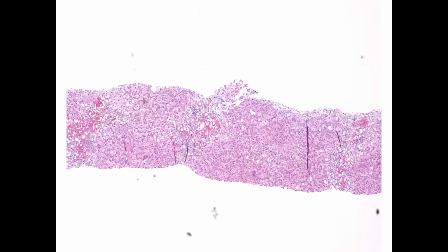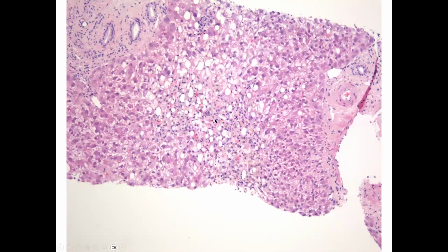This is an example of a liver where on low power you can appreciate some zonality, with interspersed areas that look like some hemorrhage and increased inflammatory cells, along with areas of preserved hepatocytes. So you'd want to take a look on higher power here. When we look on higher power, we can see the zonality. Here's a portal tract over here. Here's another portal tract over here.